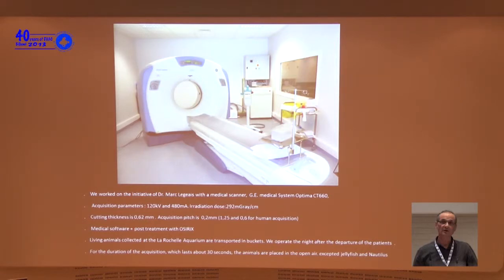For these experiments, we used living animals collected at the La Rochelle Aquarium, and we transported them in buckets. We operate the night after the departure of patients, and we took care to handle animals without contaminating the scanner room or the examination table.